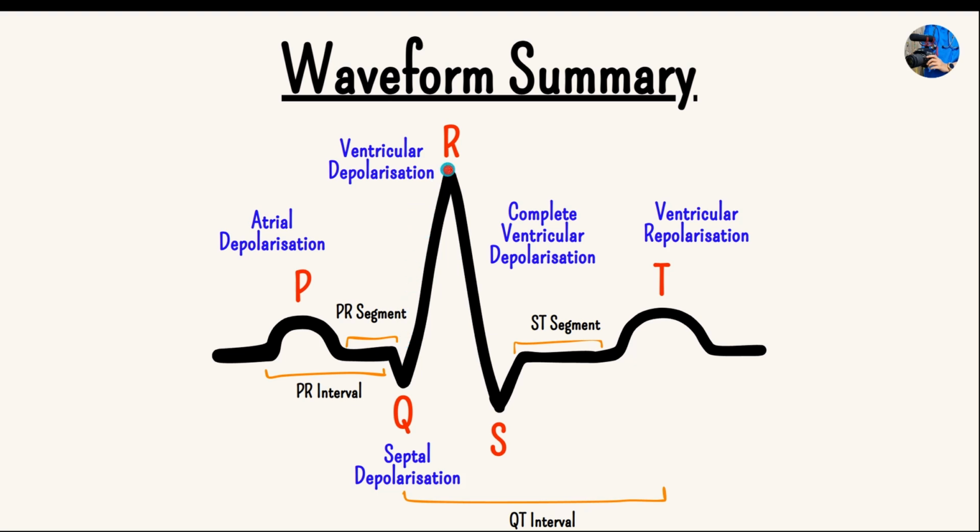As the heart is getting back down and coming into its ventricular repolarization, and as it completely becomes depolarized, we've got this bit of S wave happening and the ST segment, where the heart is moving some of that positive charge up towards the negative electrode, meaning we get a slight downward deflection and a slight pause before we move into ventricular repolarization, where all the charges are now coming back down to resting membrane potential, which is about negative 90 millivolts. And because we have negative charges traveling towards a negative electrode, we get a positive deflection.